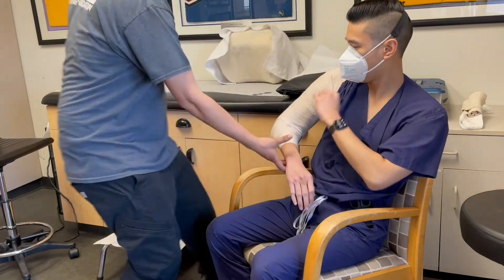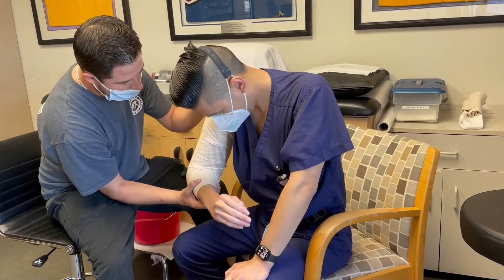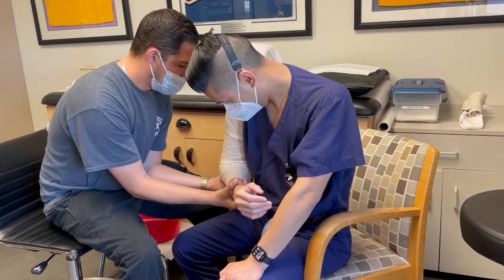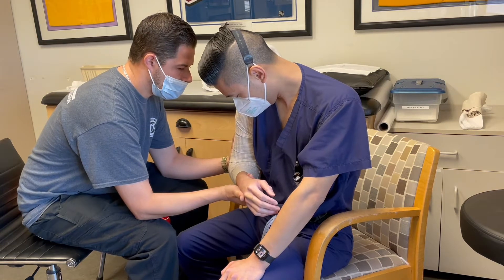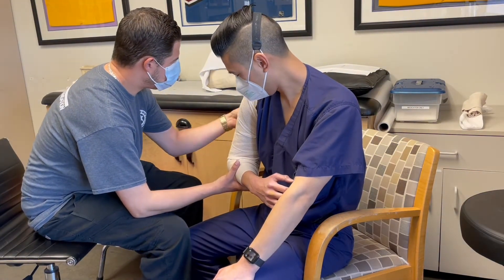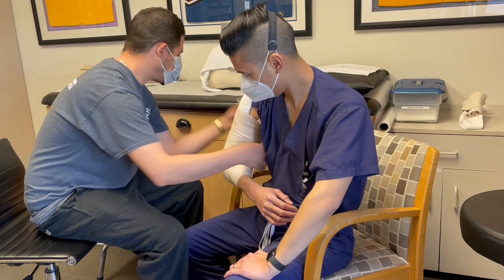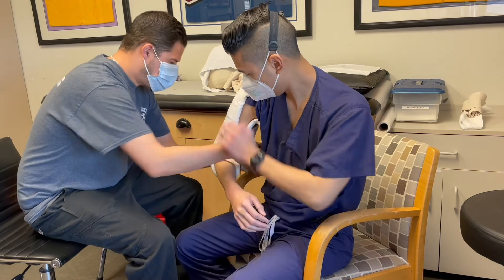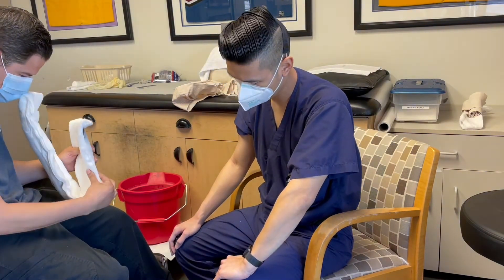Now the coaptation splint is complete. You can remove the pillow and have the patient lean forward, keeping the elbow at 90 degrees. Just have the patient relax and let the arm hang. This is the ideal position for the cuff and collar, which is not shown in this video. Before the splint fully hardens you can take it off a little early to check for creases and pressure points. Make sure the ulnar nerve is not compressed. You can add padding as necessary.